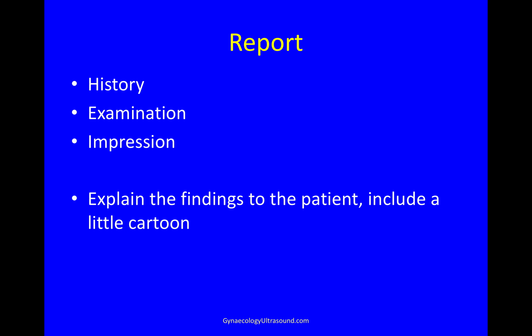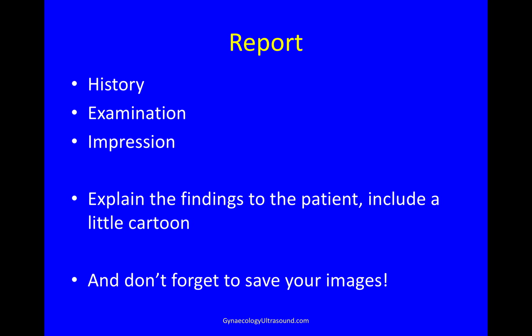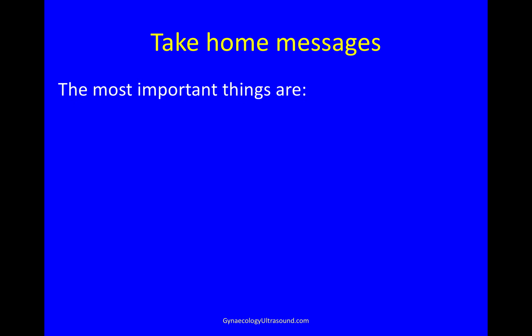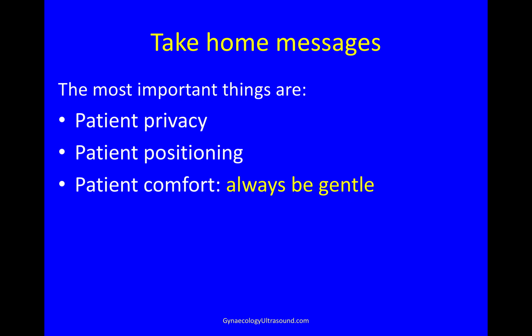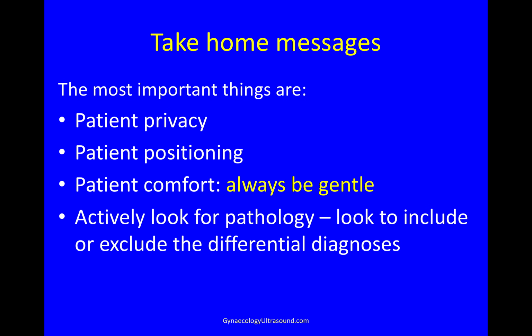For instance, fibroids, polyps or endometriosis, a little cartoon means the world to the patient. They can just suddenly visualize what you've been looking at. And don't forget to save your images, of course, it's very important. So the most important things are patient privacy, patient positioning, and patient comfort. Always be gentle and actively look for pathology. Look to include or exclude the differential diagnoses.